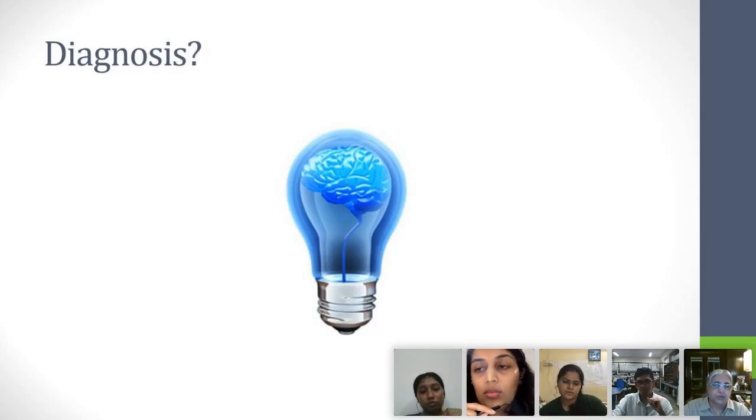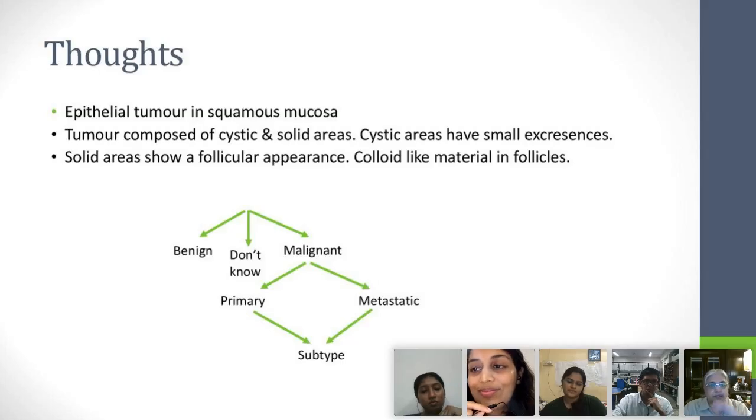How did you come to that diagnosis? Just by matching pictures? Ma'am, I was reading the salivary gland tumors, and I was looking for tumors with this eosinophilic secretory material, and when I read about this tumor, it seemed to fit, even the site. So you did matching pictures, which is not bad. If you don't know what something is, well, you can match pictures.